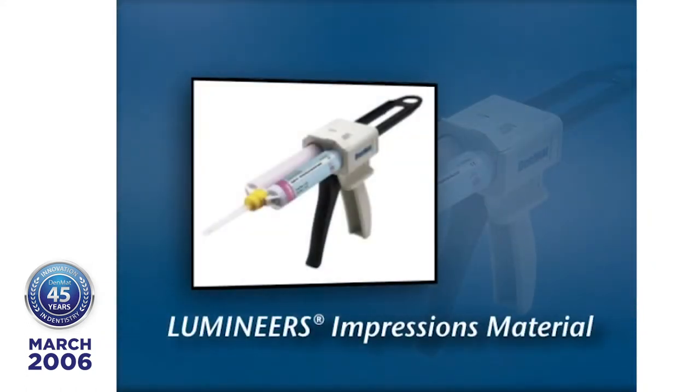The other thing that's really important is getting a good impression. It sounds simple. It is simple. We recommend the Lumineers impression material because you can take a double wash and really get precise gingival margins. We never retract the gingival tissue. We always have it stop, terminate at the gingiva. If you want to do gingival contouring, we think that's a good idea too.